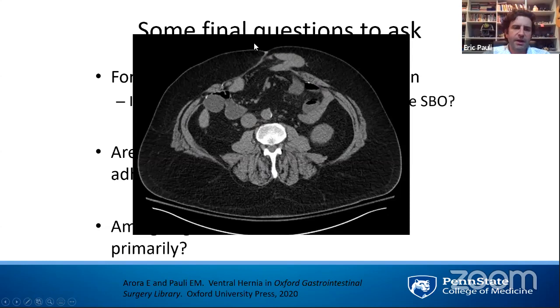Okay. Here's another patient. Here is a right-sided rectus abdominis muscle here. And this thing right here that has no plane of separation between the rectus, that's another loop of bowel that actually heads down to the ostomy that's in the patient's left abdominal wall. And if you look a little closer, not only is there this loop here, but there's this loop right here with no plane. You know what this is, Dr. Dosimo? This is the duodenum. And then this thing right here is the gallbladder.